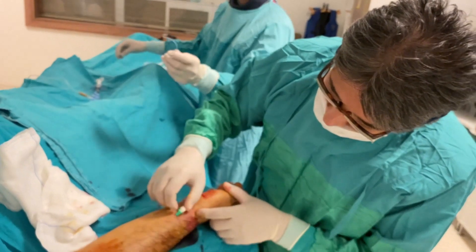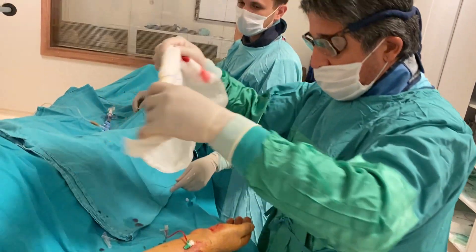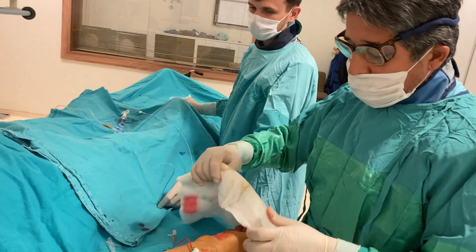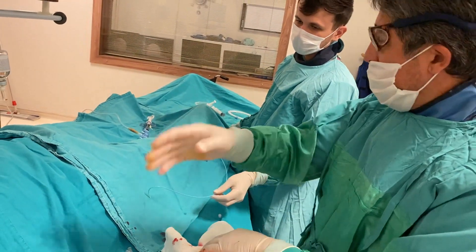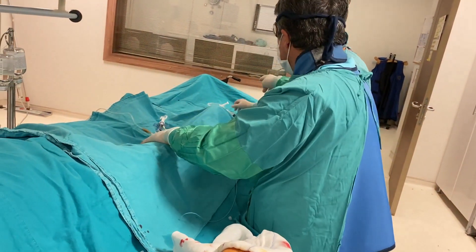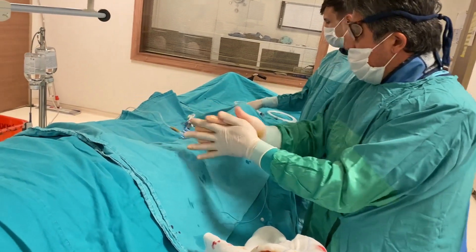Bu şekilde sabitlemiş oluyoruz. Şimdi anjiyoya başlayacağız. Yolumuz açıldı, artık atar damara doğru gidebiliriz. Hissedeceği bir şey yok.